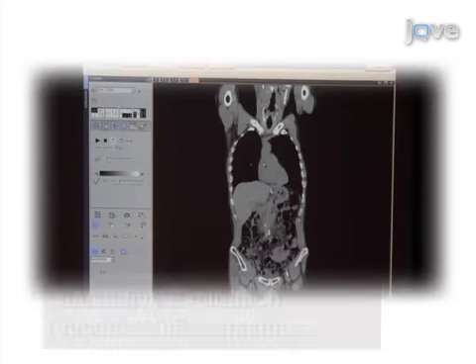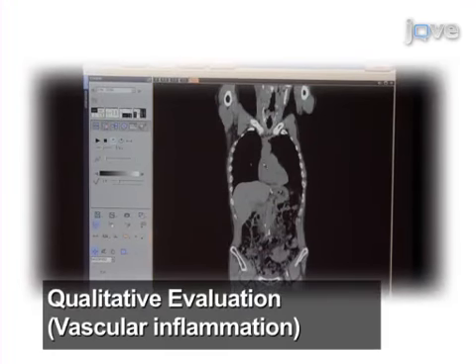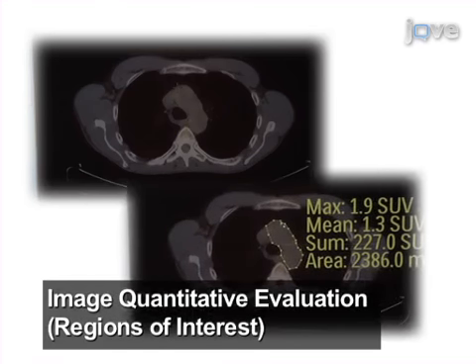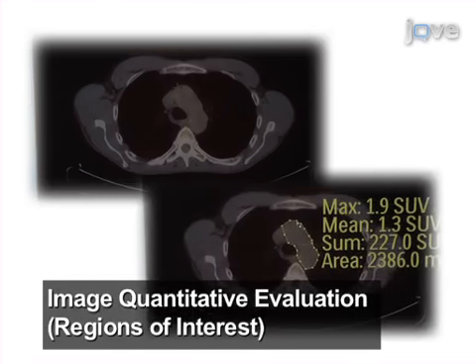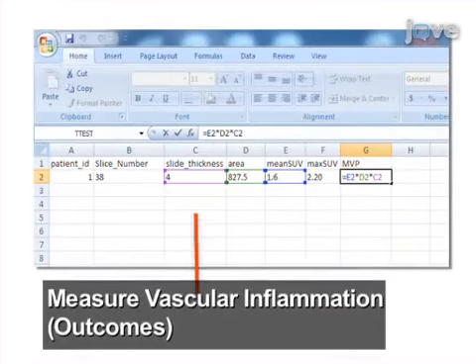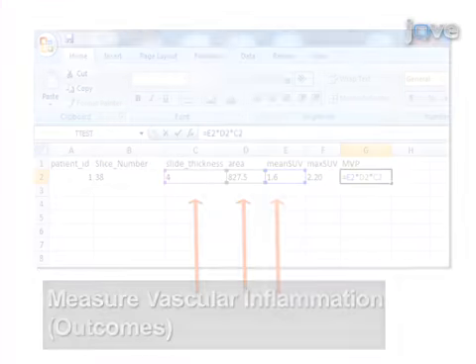Then qualitatively analyze the images for presence of vascular inflammation. Using the registered CT scan, quantify the amount of radiotracer detected at each slice of the PET scan and localize regions of interest. Proceed to calculate the standard and novel outcomes that measure vascular inflammation.